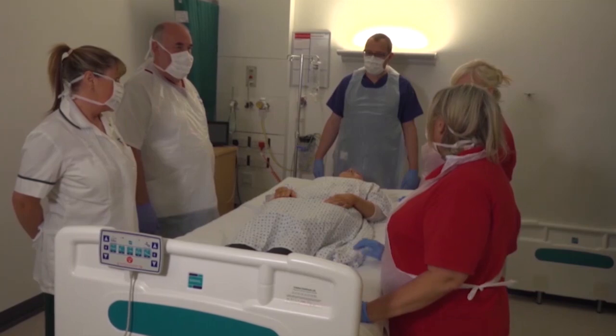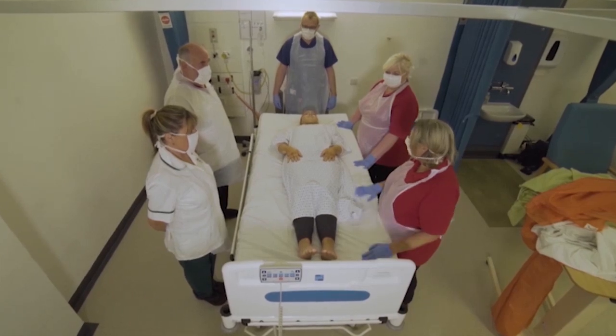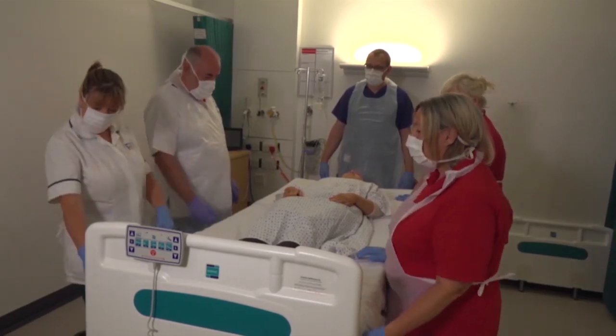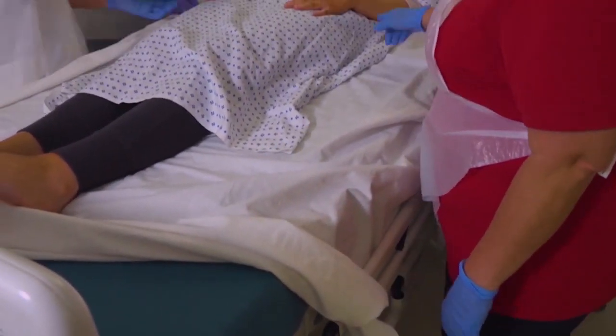What we're going to do today is we're going to turn our person from supine into prone, and we're going to use pillows and we're going to use two top sheets on top instead of one. First of all, we're going to untuck this bottom sheet and we're going to apply a slide sheet.